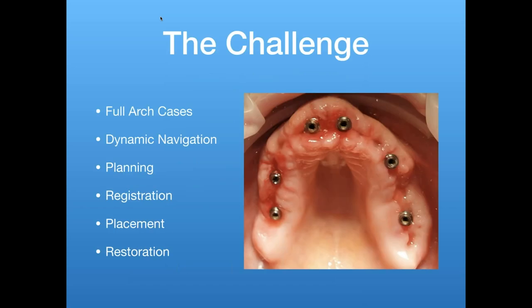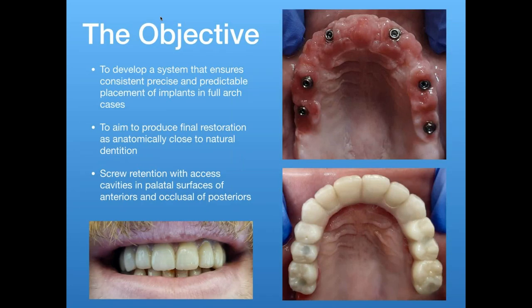The challenge with full arch cases is how do we get decent planning, our registration, between the CBCT scan and the real patient? How can we get accurate and precise placement of the implants and get a predictable restoration at the end of it? So the objective for me was to develop a system that ensures consistent, precise and predictable placement of implants in full arch cases, whether they be edentulous cases or immediate cases, and to produce a final restoration that is anatomically as close to the natural dentition as is possible.